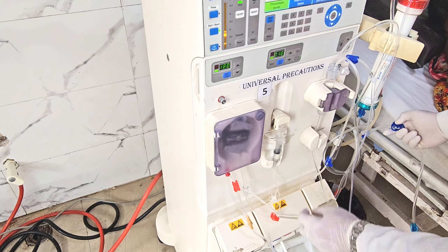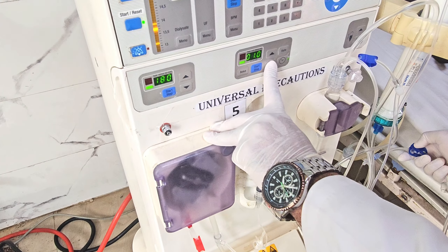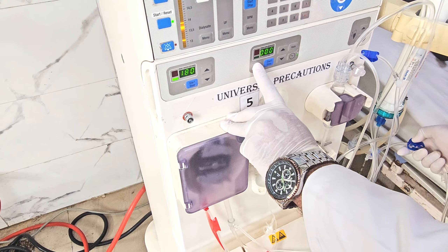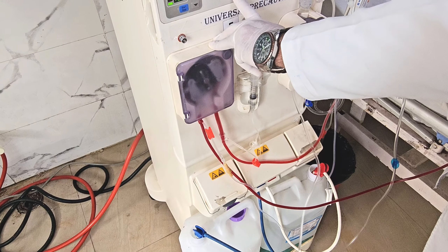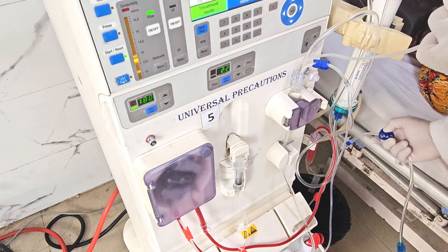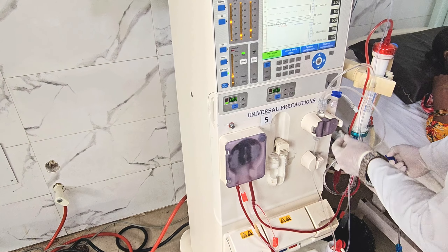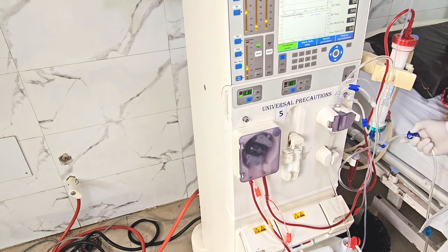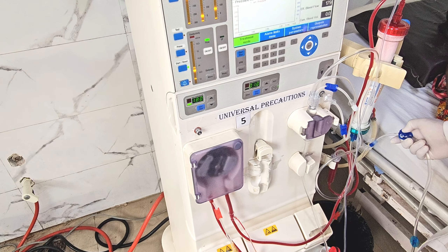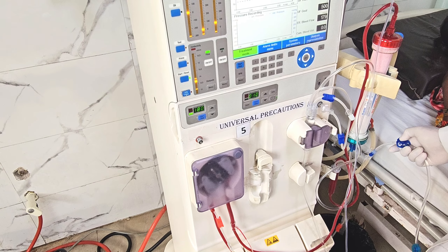Blood starts entering the circuit. The start button is pressed, pump speed is increased, and the initial heparin bolus is being given. The tubings are turning red with blood. This concludes the demonstration. The video aimed to give medicine and nephrology residents — especially those at the beginning of their careers — an understanding of how to start dialysis, from switching on the machine through to blood pump rotation, since many residents join dialysis postings when patients are already connected.